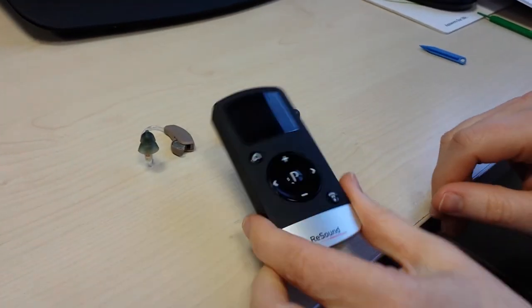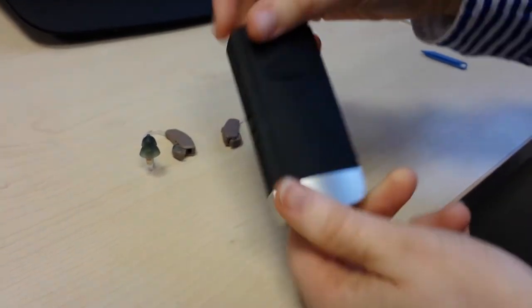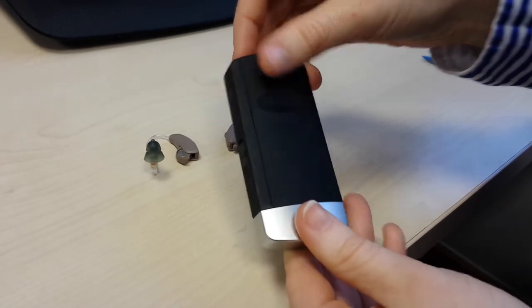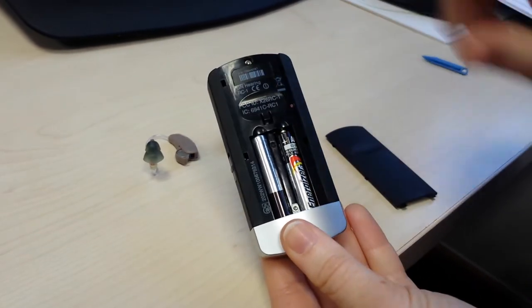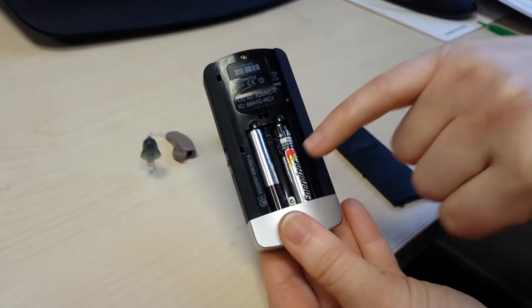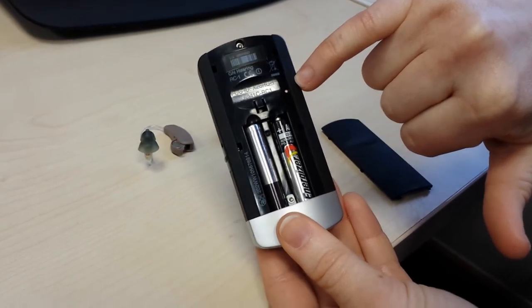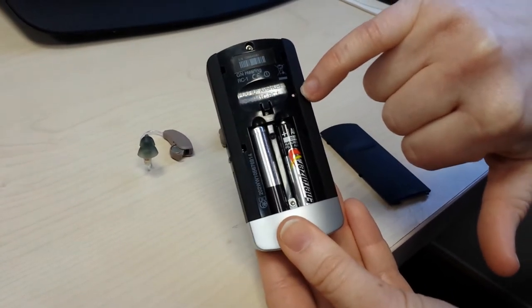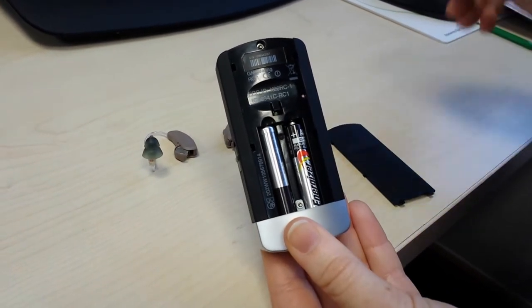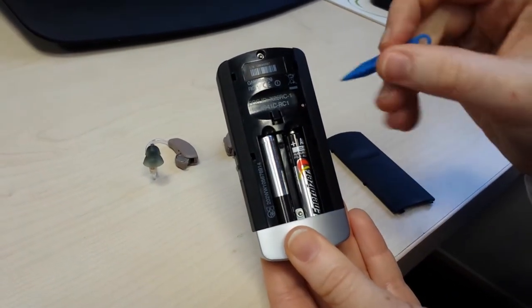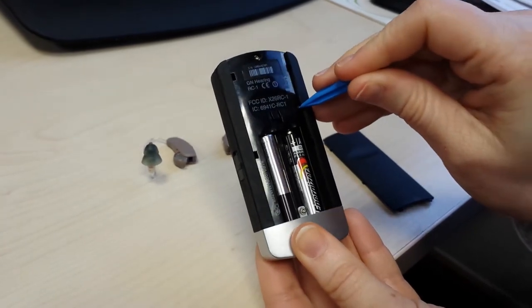Take the remote control, turn it over and remove the back case. By the batteries you will see a very small red button. Press the button down firmly using a pin.